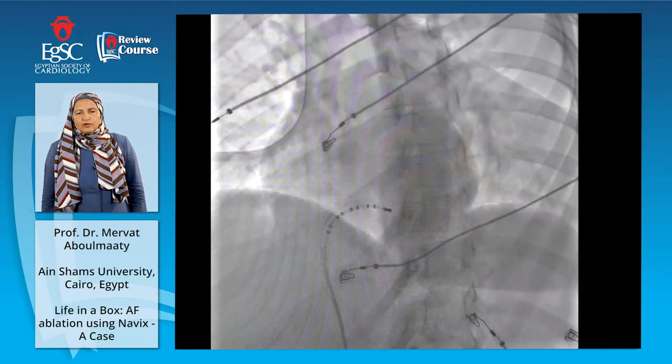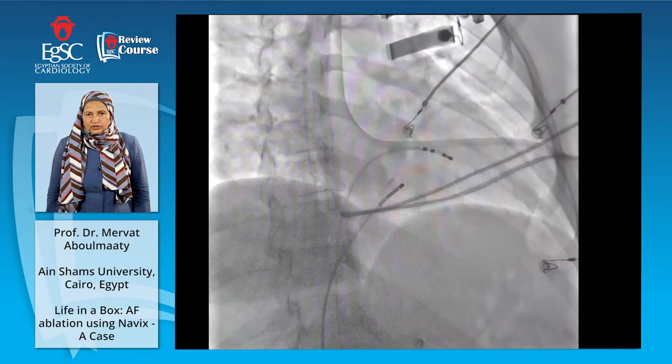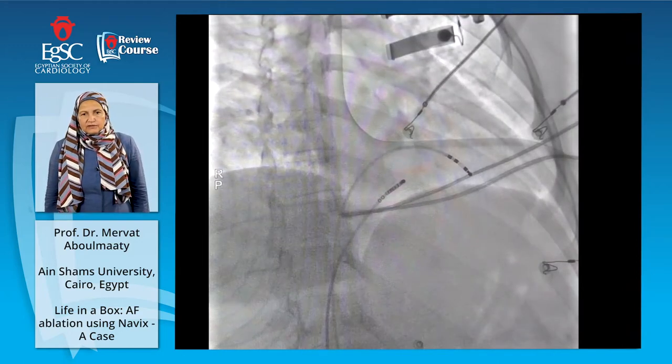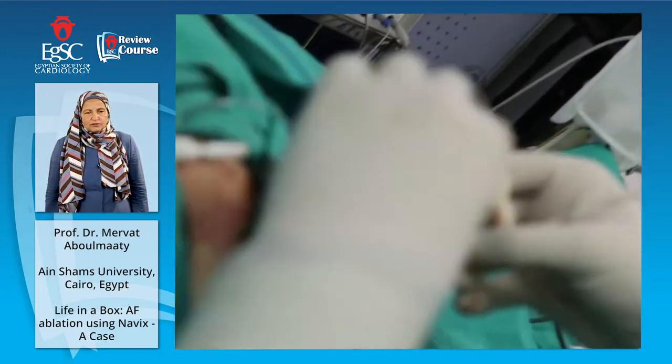Then a decapolar deflectable catheter is inserted into the CS, as you see, very good insertion. This is in the left anterior oblique view. And his catheter, quadripolar catheter, will be placed into the his position.